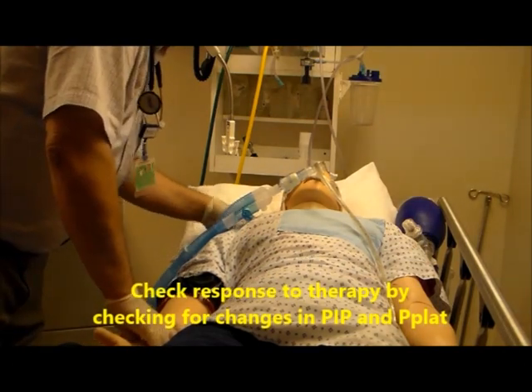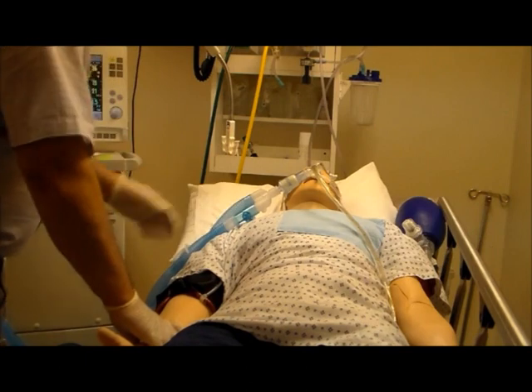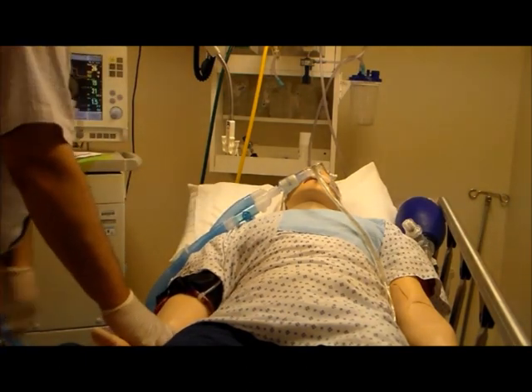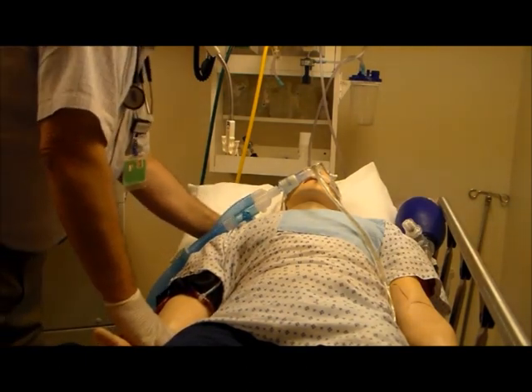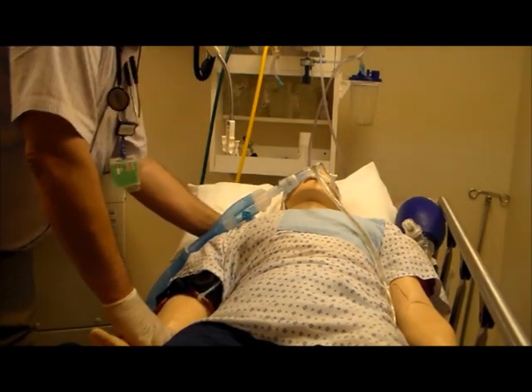Breath sounds are improved. Thank you Mr. Smith, and your pressures have gone down. Very good, have a good day.